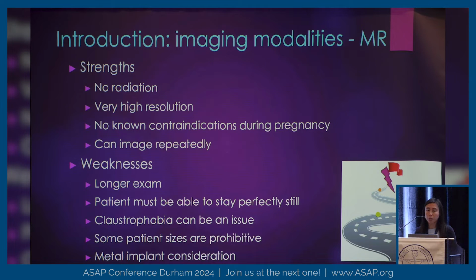We have a lot of patients who are not comfortable laying in our scanner, even for a short period of time. They are larger bores now. The donut that you go in is not as narrow as it used to be, but still a lot of people are uncomfortable. I've had patients crawl out, even at the beginning of the exam, literally cannot stay inside the scanner. So we sometimes give medication like Ativan or something to calm patients down, but some really are not comfortable. So that can be an end game for someone who really needs an MR.